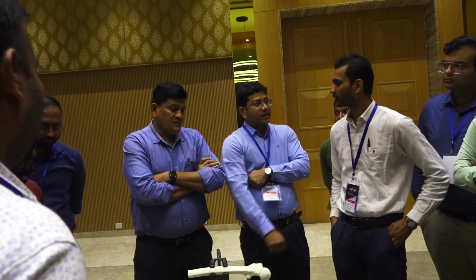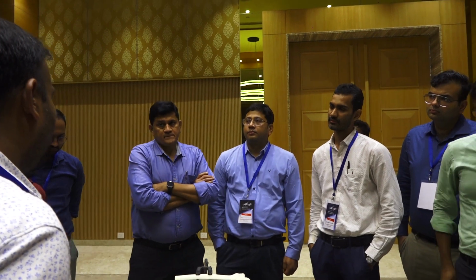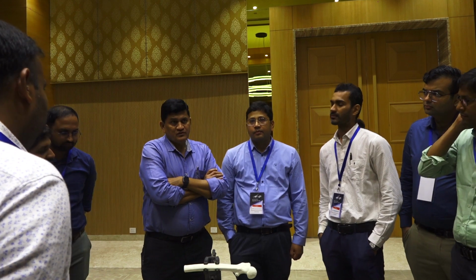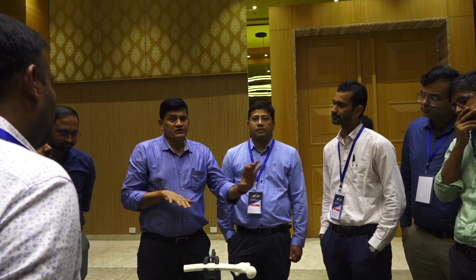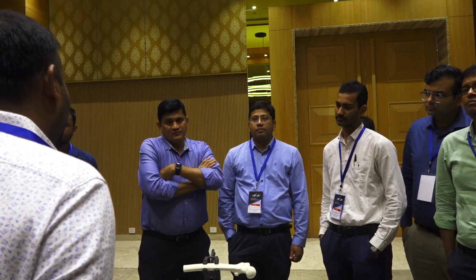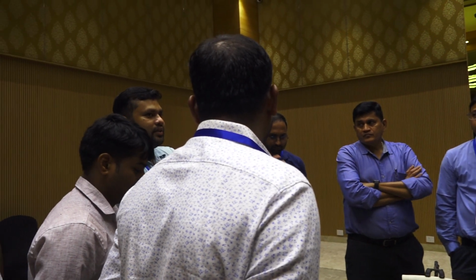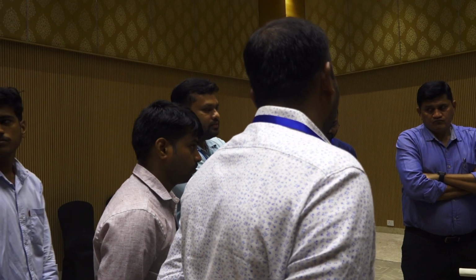We are not putting anything. We are just reducing the fracture with some K-wires, anterior and posterior, then we can adduct the patient for the entry. Okay. Yes, you try to reduce and put an anterior K-wire and a posterior K-wire, so that you do not interfere in the nail pathway. Most of the times we have in mind that we put the patient in adduction first, then we reduce and give the entry. But that's not correct. You have to reduce it first.